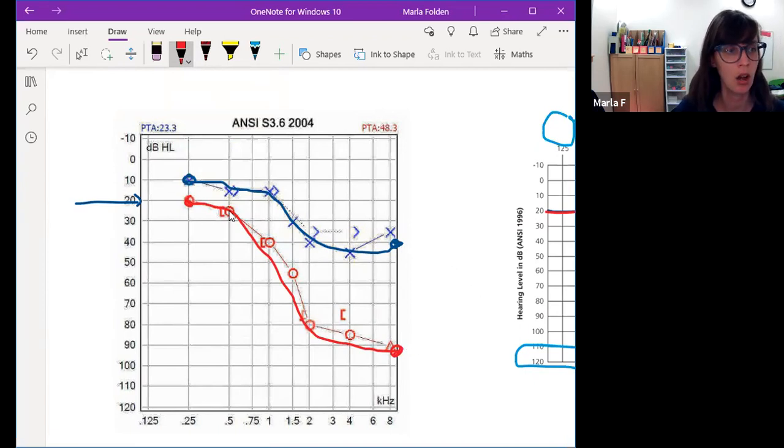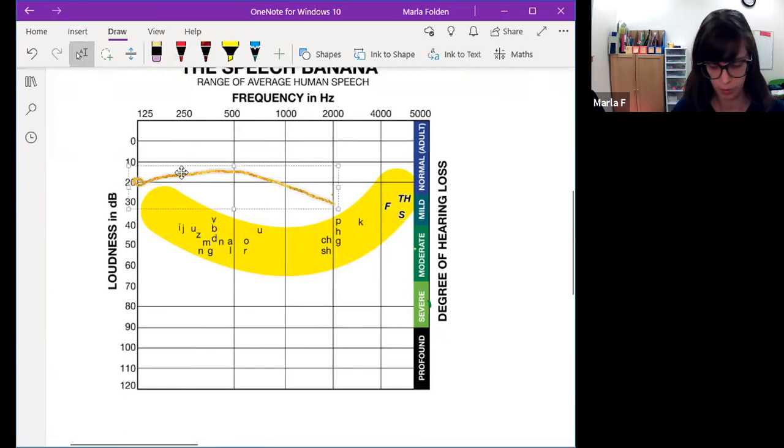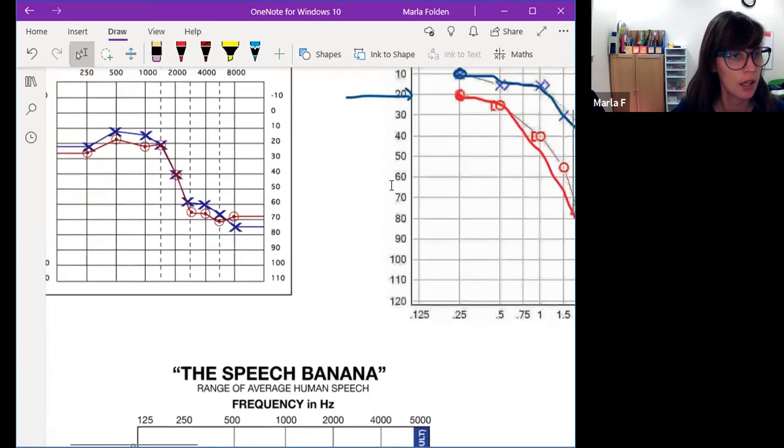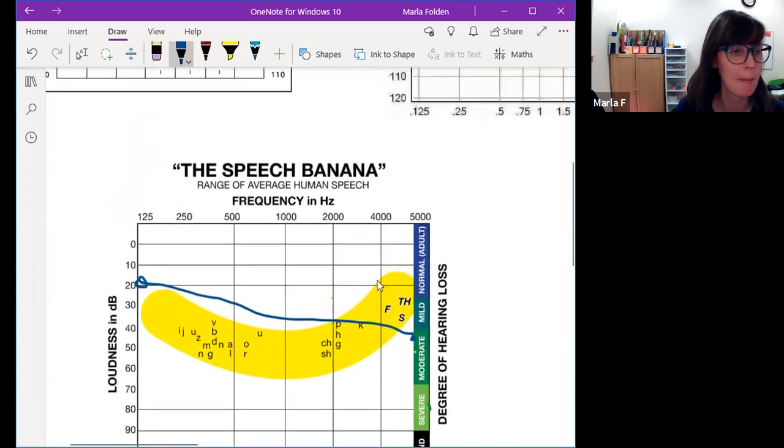I'm going to overlay these onto what we call the speech banana. When we think about speech sounds, they kind of fall into this arc right here. This guy started with normal hearing on the left, around 20, and it dipped down to about 40, 45. So we're going to connect our dots. Everything above this line, that person can't hear. That's important to know. If you're working on the S, the S, the TH sound, and their line, their audiogram line is here, they can't hear you when you do that, especially if they don't have a hearing aid.